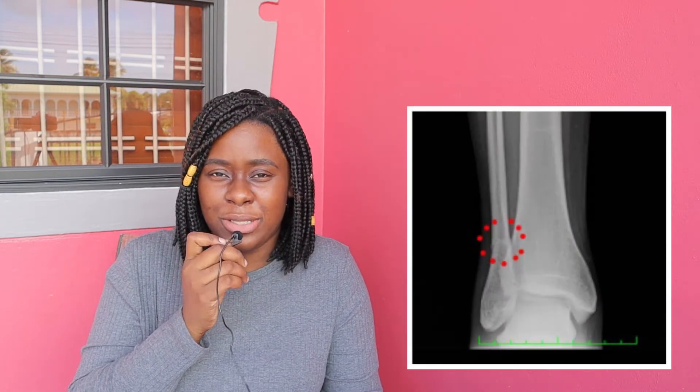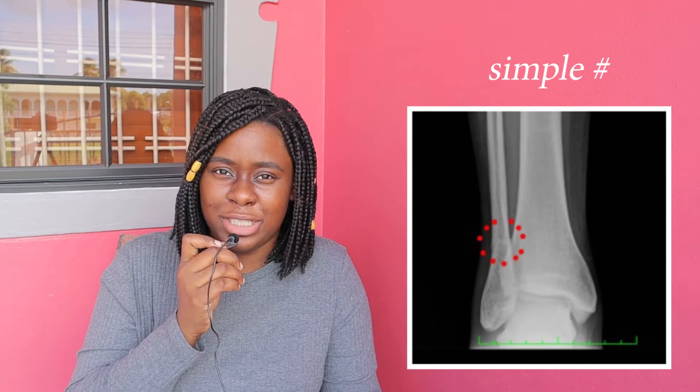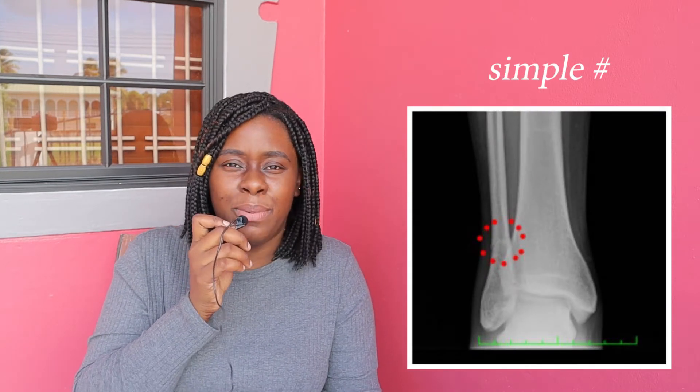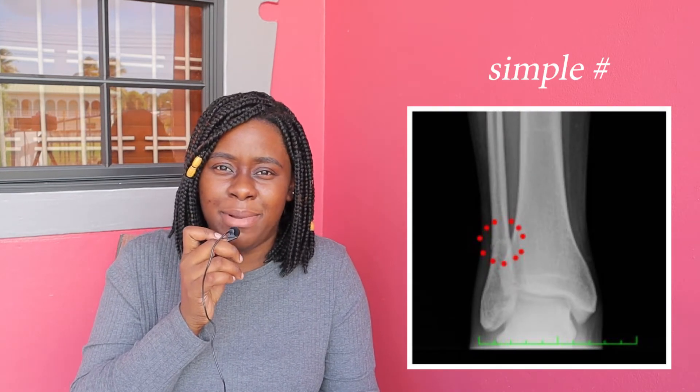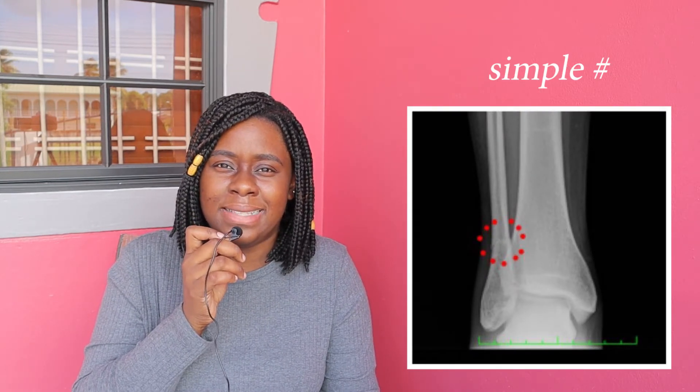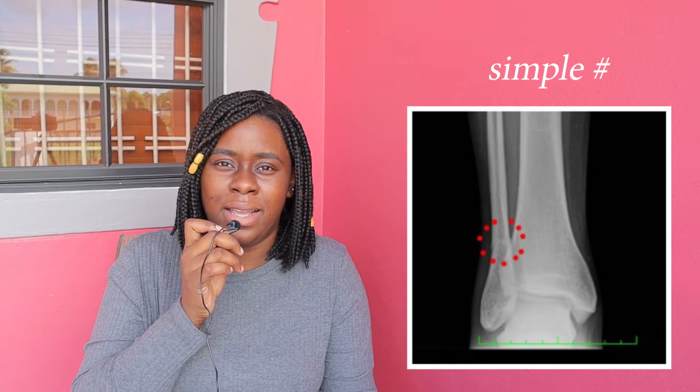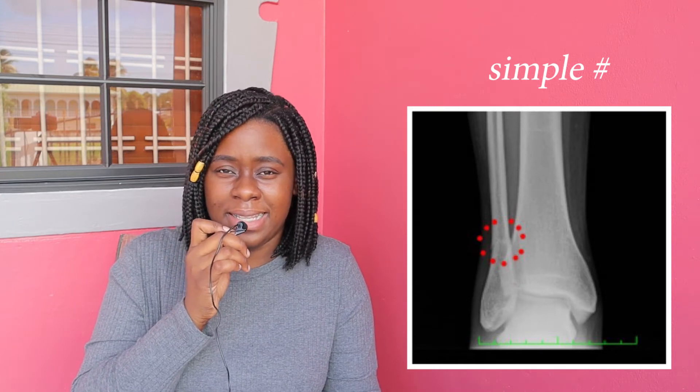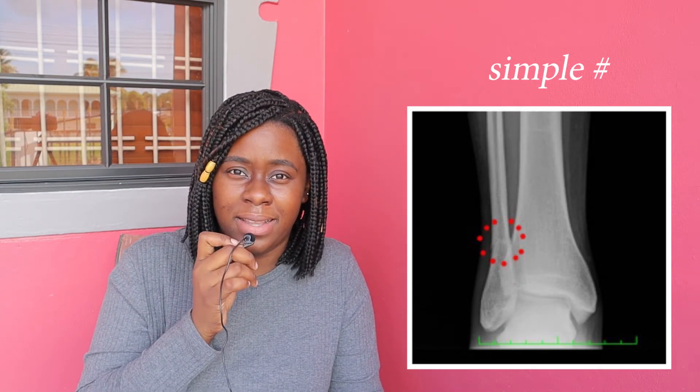The next fracture is of the right distal fibula, called a simple fracture. We can see it is non-displaced — the bone still lines up — but there is a dark lucent line signifying a discontinuation in the bone.